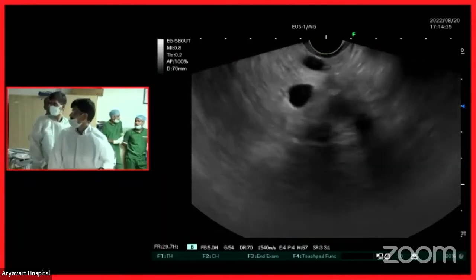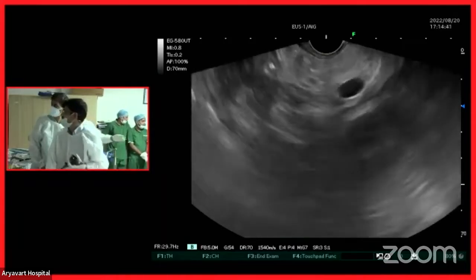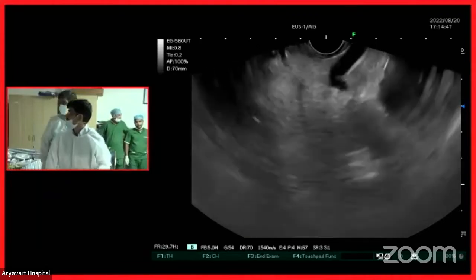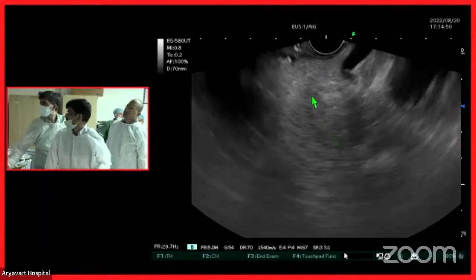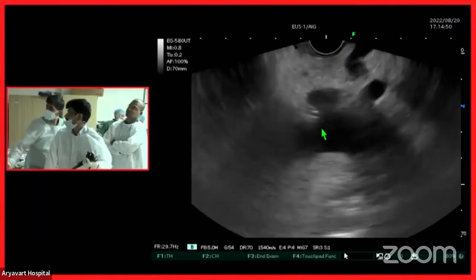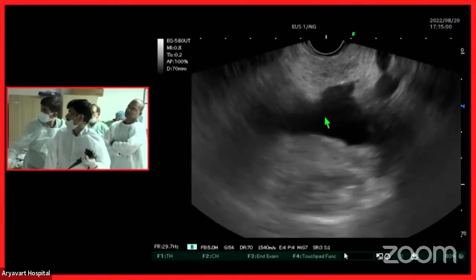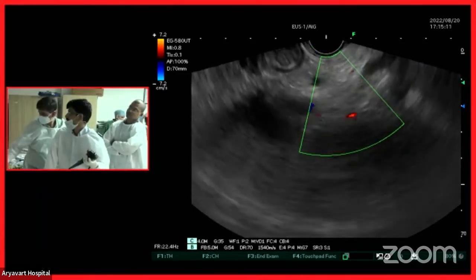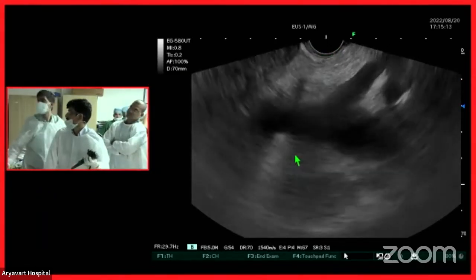And just checking on the pancreas quickly. So splenic vein, splenic artery. I haven't yet seen the PD, but it's clearly not jumping at us. It's not dilated. I think this is the PD going through, the waterfall sign falling through the neck. That's a non-dilated PD. And this is the confluence of the portal vein, splenic and mesenteric veins. And the uncinate is across on the other side of this portal vein, below the portal vein.